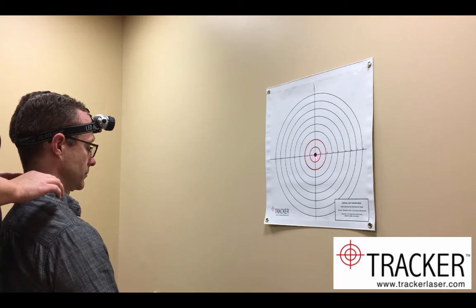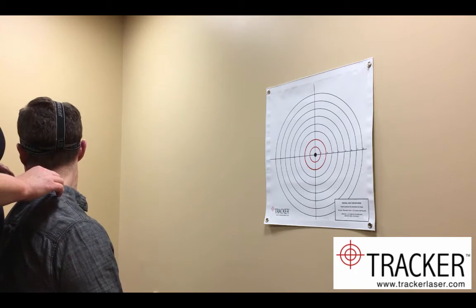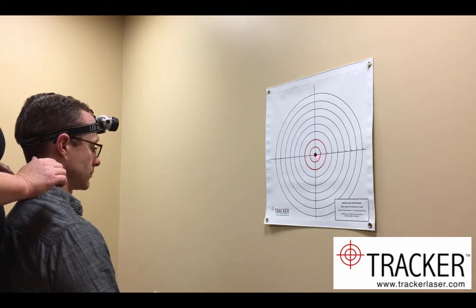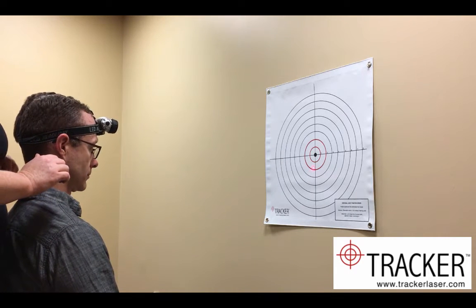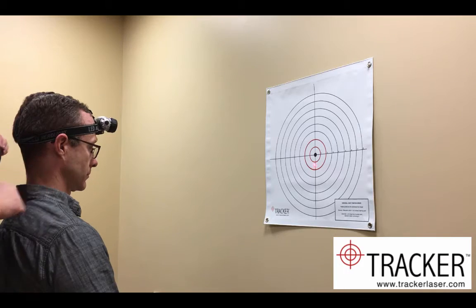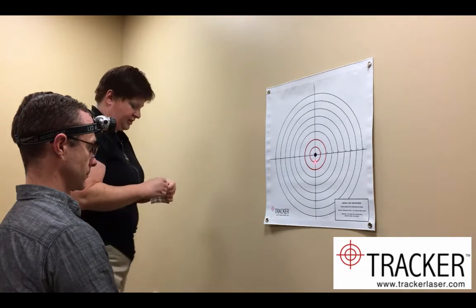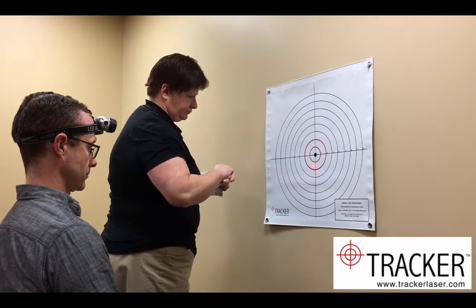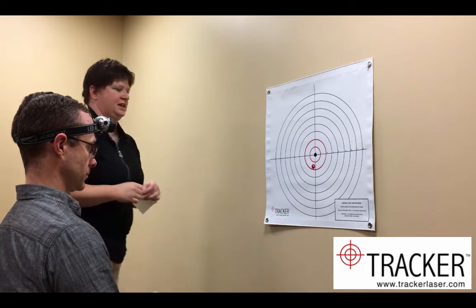Good. Now keeping your eyes closed, turn your head all the way to the left like you're checking a blind spot and come back. Alright. Go ahead and open your eyes. You can mark their first trial with a dot.